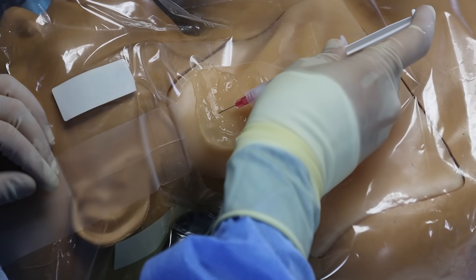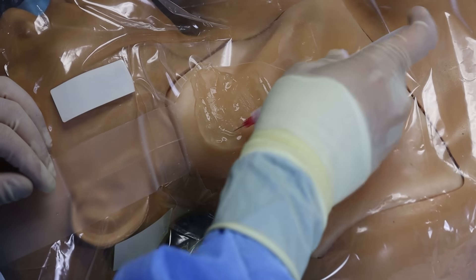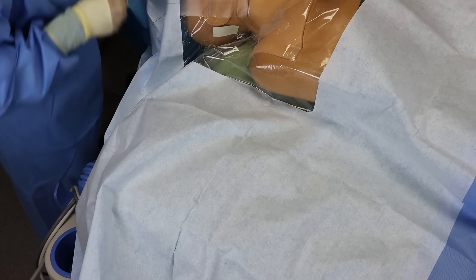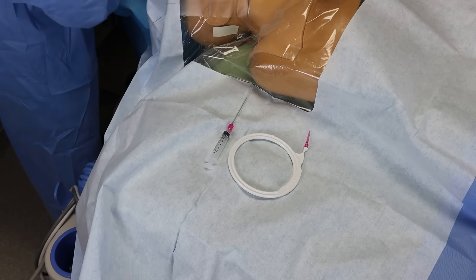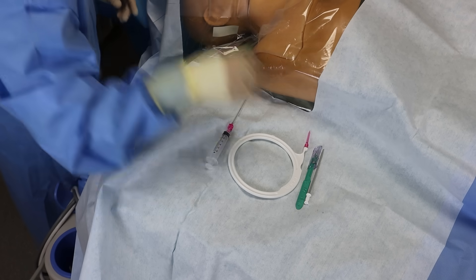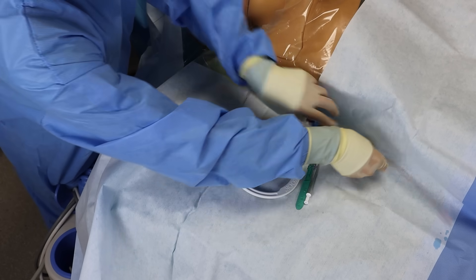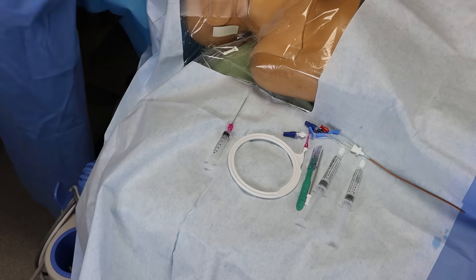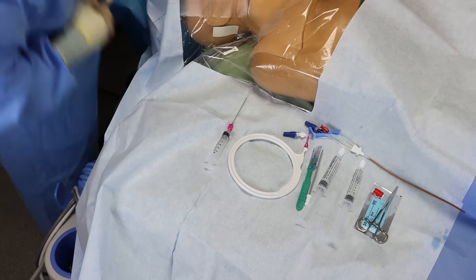It's important to remember that you will be sewing the line in, so you also need to inject where you anticipate the suture needle will be passing. Now you'll want to wait at least a couple minutes for the local to take effect. While waiting, one of my favorite things to do is to stage all the equipment I'll be using in the order I'll be using them. I really love doing this for two reasons: number one, it forces you to mentally rehearse the steps of the procedure in order before you even get started.